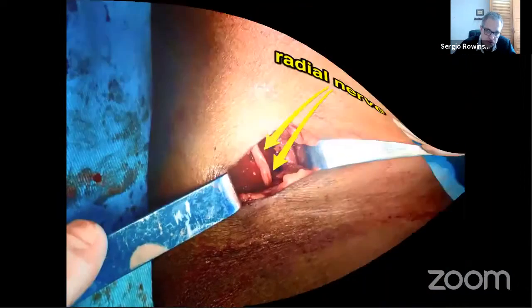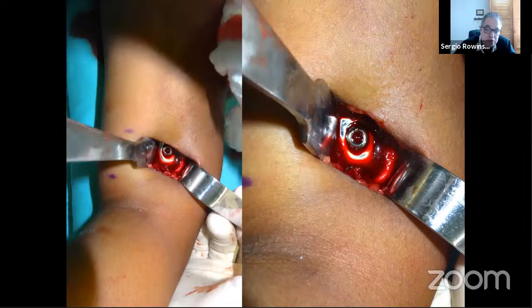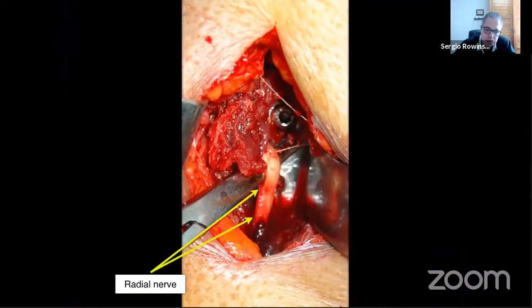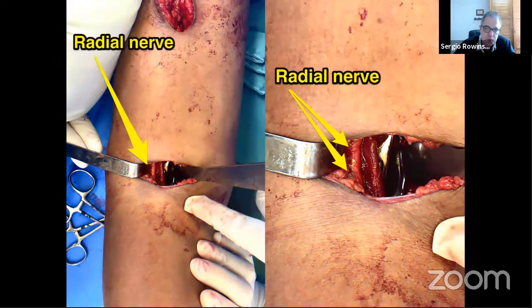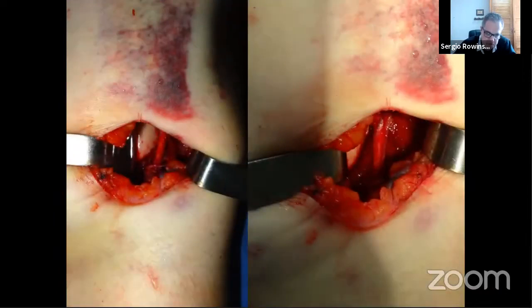So this is the radial nerve. This is another case, on the left, a very distal case, the radial nerve. We are seeing here the radial nerve, left arm. This is another right arm radial nerve. This is another case that I did in December, the radial nerve. This is another case, a left arm, the radial nerve.